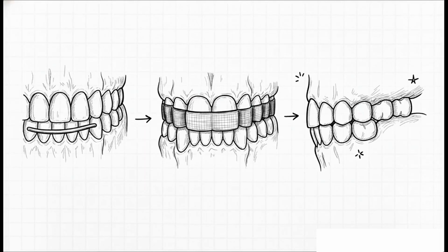But biology likes to throw roadblocks at us, right? Choosing this foundation beam means navigating those roadblocks. In the lower jaw, you always want that lingual bar, but if the patient has a high floor of the mouth or maybe bony growths called tori, you might actually be forced to use a lingual plate to stabilize everything. Up top in the maxilla, a palatal strap is great for tooth-borne cases, and structurally speaking, you always have to extend those distal bases all the way back to specific anatomical landmarks, like the retromolar pads and hamular notches, just to distribute that bite force as widely as humanly possible.